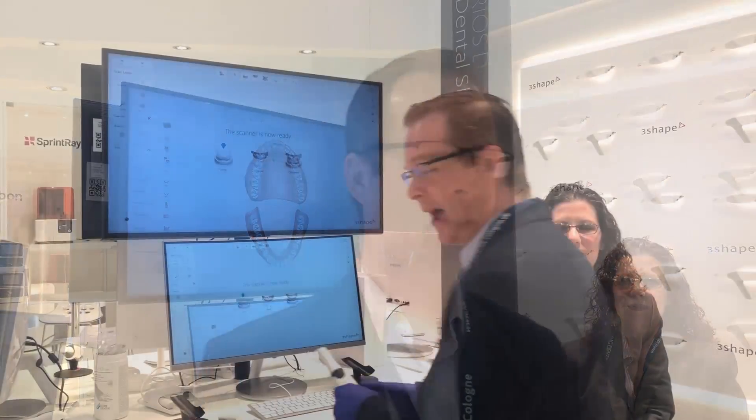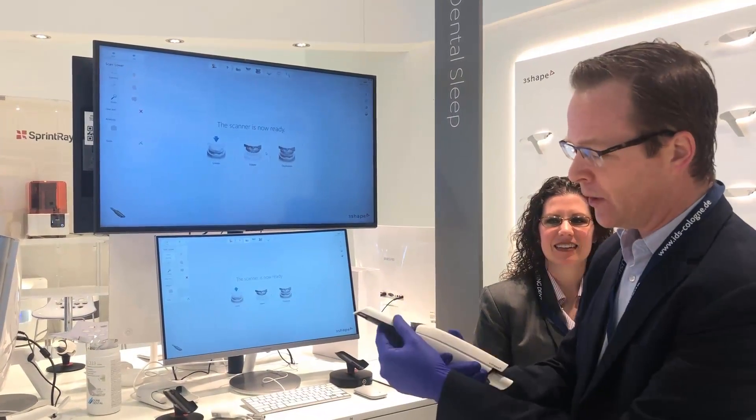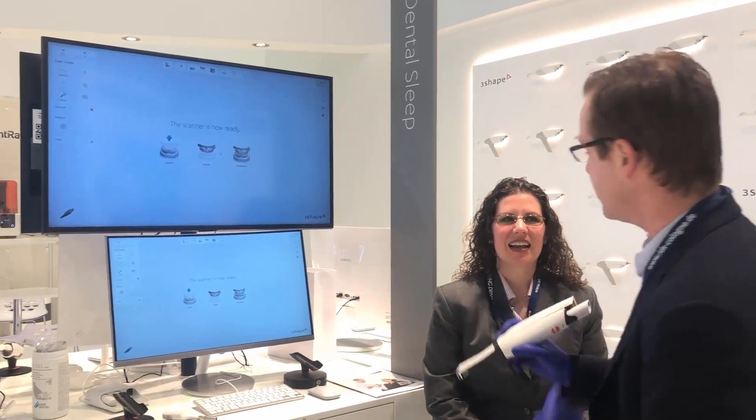What we're going to do today is a demonstration of the Trios 4 and really put it to the test. I have my Trios 4 wireless with the tip installed and ready to go. We're going to jump in and start scanning.